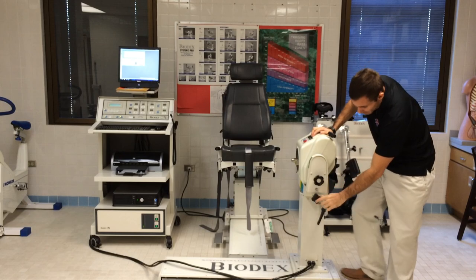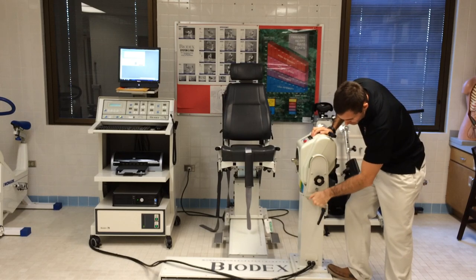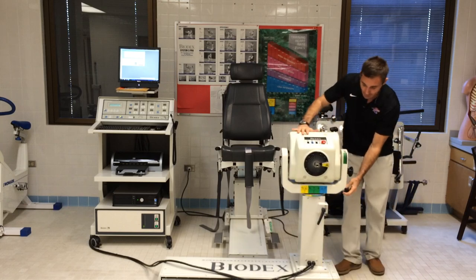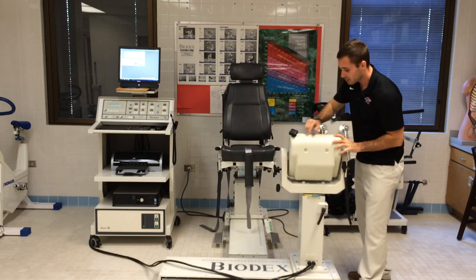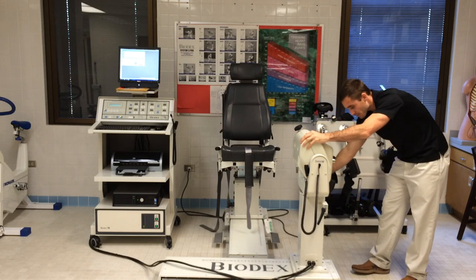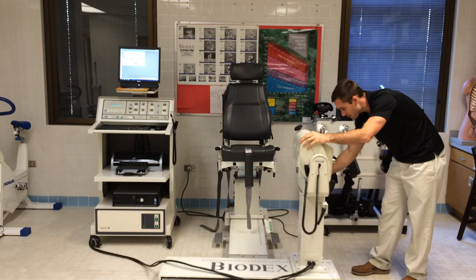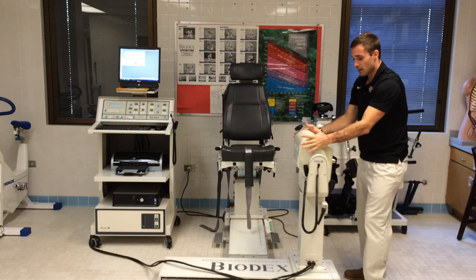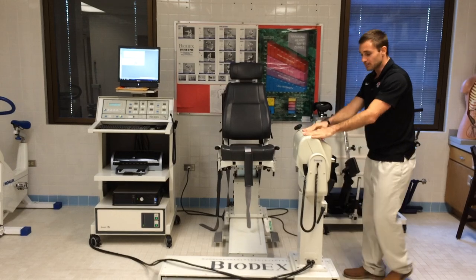Right here, we have a knob that we can turn. By turning this, it allows us to turn the whole unit. So we want to turn our whole unit around so that it's at 90 degrees in the opposite direction from which it was. And there's numbers on here that correspond. You just need to find the 90, line it up, and make sure it's locked in. So now if I try to turn it, it's locked in.